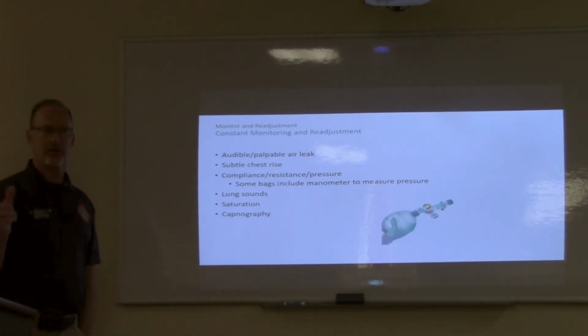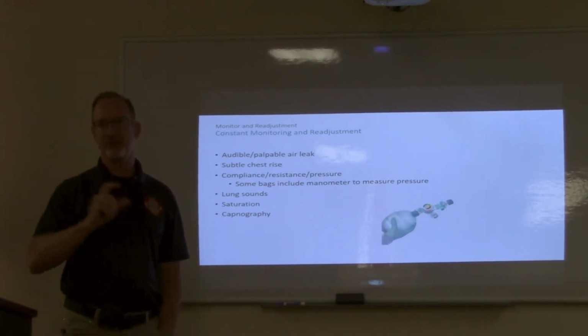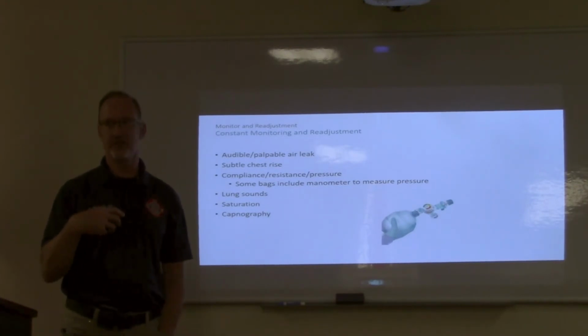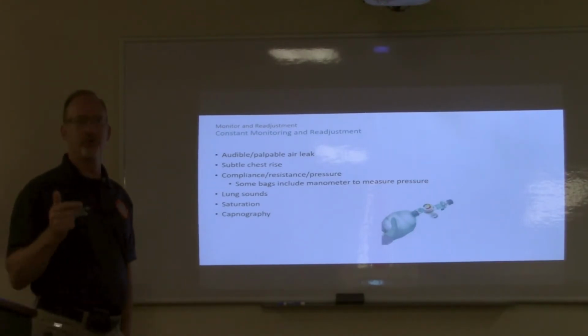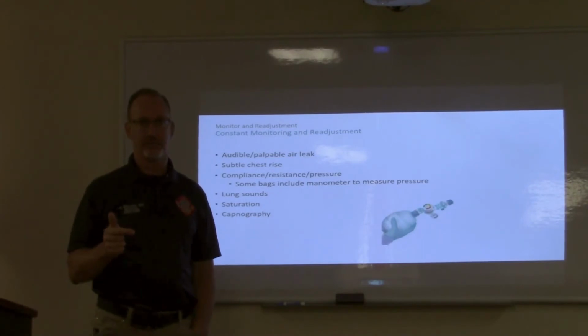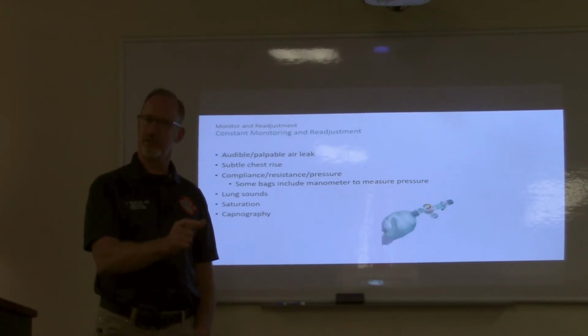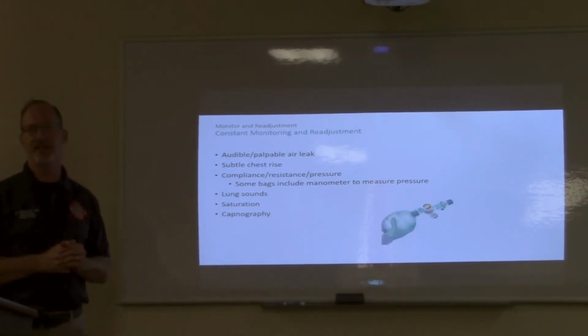Now it's a little trickier for us when we're dealing with, by definition, sick people, and their CO2 can be all over the place just based on their underlying physiology, especially if they're really acidotic, which is common. But you can still tell: if the first CO2 when you put it on somebody who's really sick is 20, and they're not coding, and then they're at 10, you can still assume, hey, wait a second, maybe I'm overventilating, and vice versa. But there's yet one more piece of information that we can get from capnography that's super important.